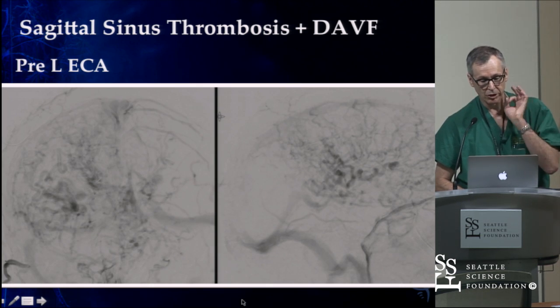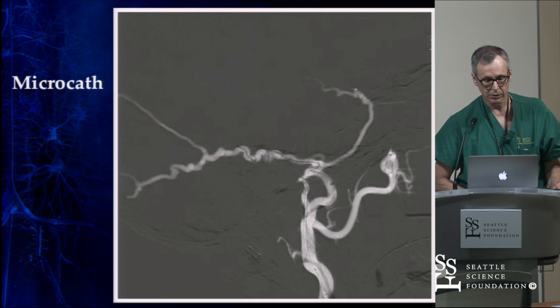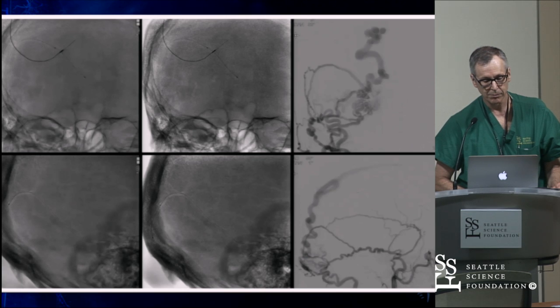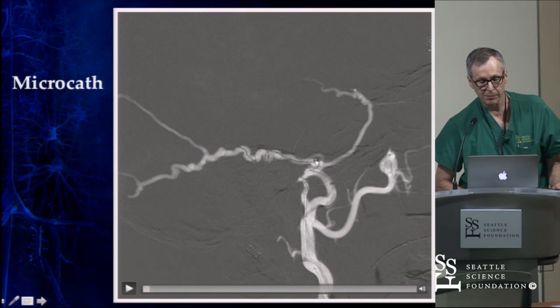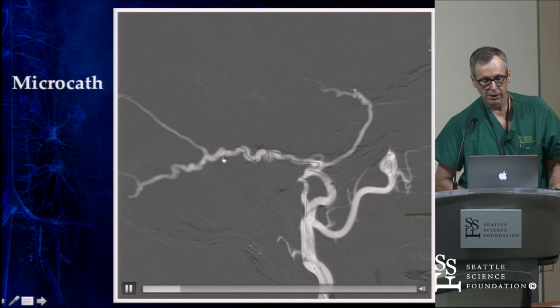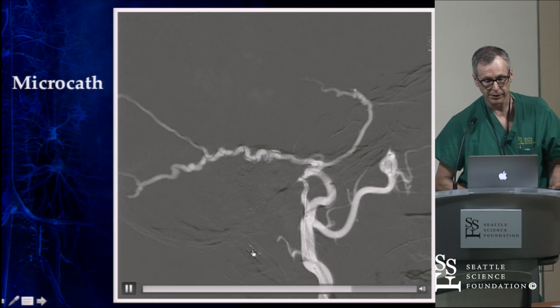So that's the key thing, to locate the fistula, and after that it's pretty straightforward. So I showed you the internal. This is the catheter manipulation. I'm really messing up on my arrows here. That's the one I want. The catheter here is being manipulated. This is a little bit tortuous. I wasn't sure we were going to get through that. But once you get through this segment and onto the straight part, it's pretty clear sailing all the way back to this fistula. I don't know if you can see that or not. Now we're there, we're away to the races.